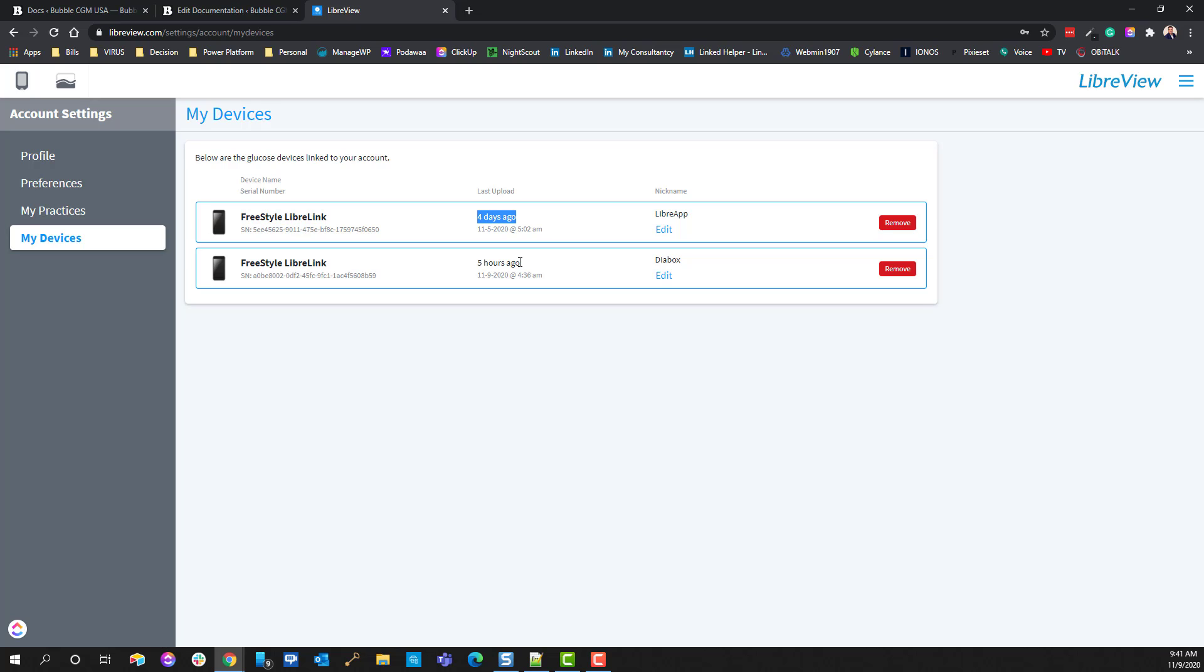So when I do a sensor change, I have to use the LibreApp to tap it to activate the sensor to get it going, and then after that LibreView goes ahead and, not LibreView, sorry, Diabox will go ahead and kick in and do what needs to be done.